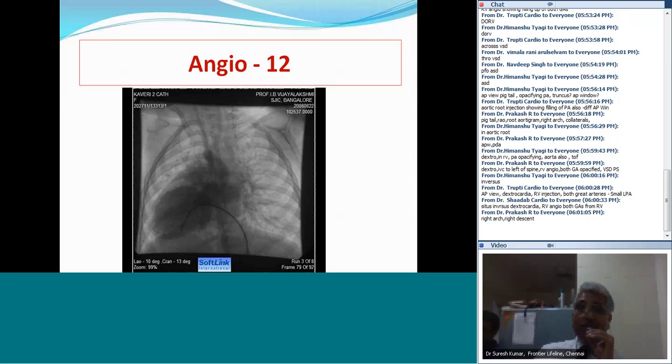So you said it is situs inversus because you could identify the aorta and the inferior vena cava being on the wrong side. With the situs inversus, you further confirmed that the RA is to the left side because the venous catheter is clearly entering the left heart border. With that, you are seeing a smooth walled ventricle. So you know that there is an atrioventricular discordance. With the atrioventricular discordance, you find that the injection of the smooth walled ventricle is showing the pulmonary artery. Therefore, you have a ventriculo-arterial discordance.